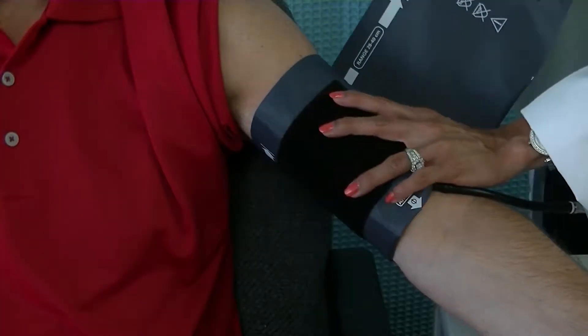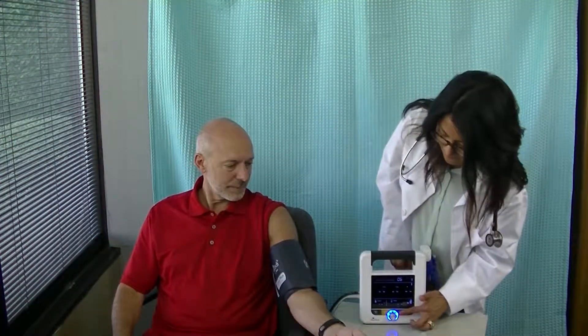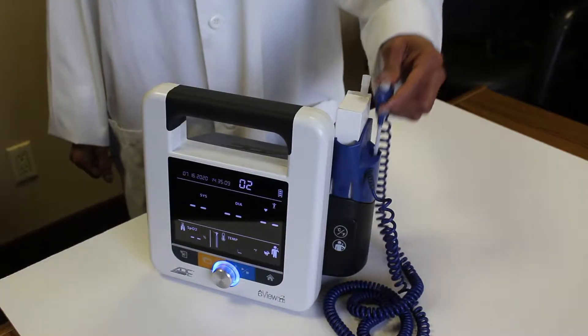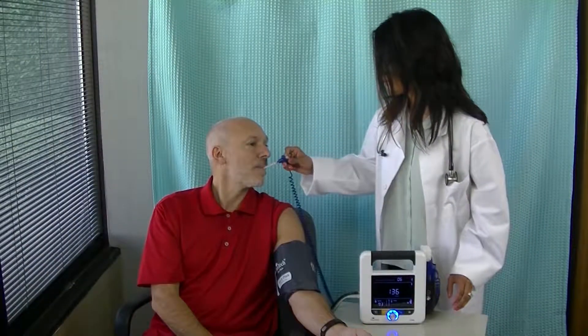Begin the measurements by properly applying the cuff to the patient's arm. With the cuff in place, press the Stop Start button. Place the SpO2 sensor on the hand opposite the blood pressure cuff. Next, remove the temperature probe, put on a probe cover, and place it in the patient's sublingual pocket.